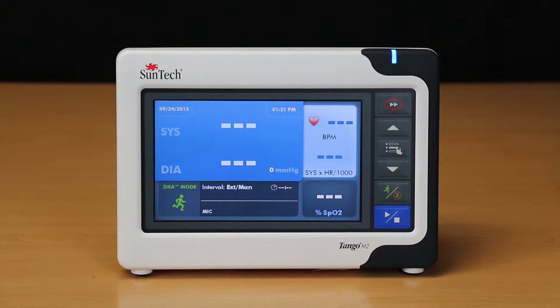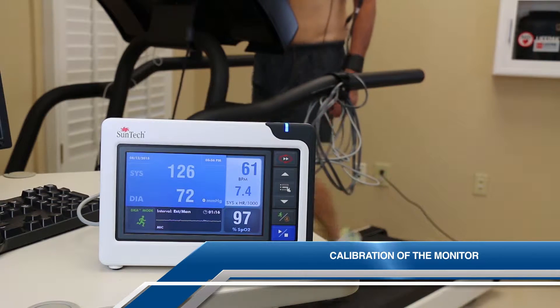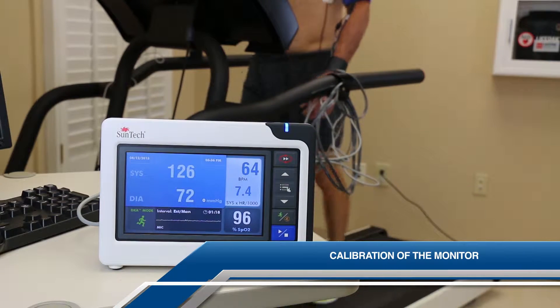There are various checks that are helpful for biomedical engineers when checking the Tango M2. First, check the calibration of the monitor. We recommend that this be done annually.